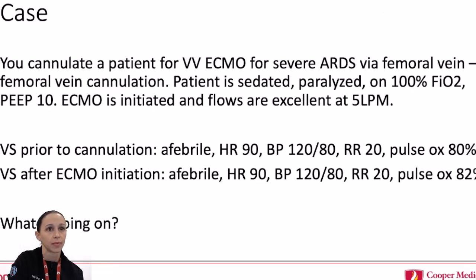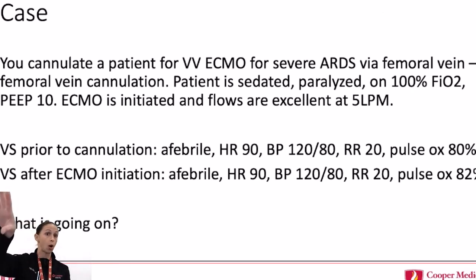Did we put the FiO2 up? So very good. So when we talk about oxygen to the circuit, one, we're flowing great, right? I think all of us would be thrilled to have flow of 5 liters a minute. So is there actually oxygen going into the membrane? So that's a great comment, and this has happened to us. Usually we're using wall mount oxygen unless we're traveling, where we can use tank oxygen.